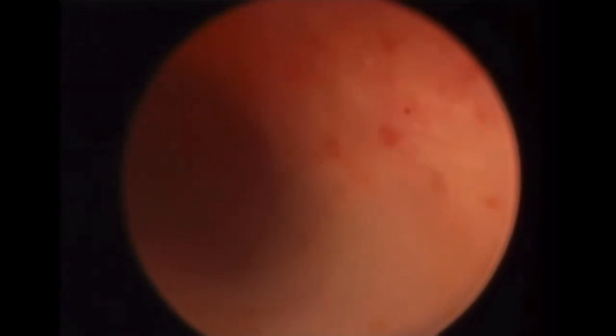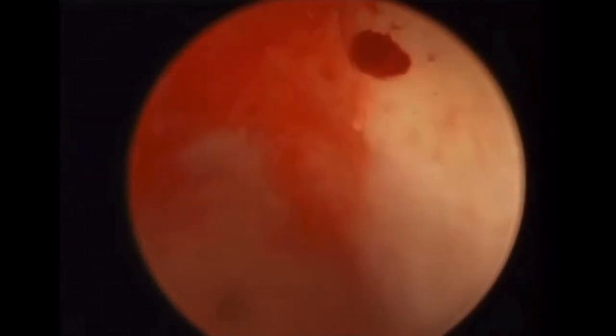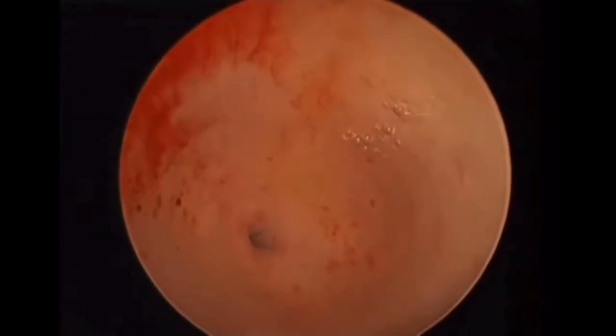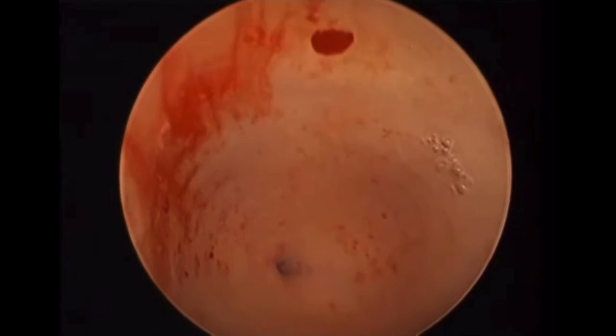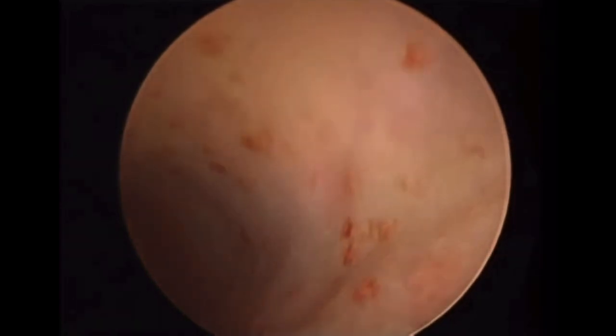Stand and pause a little. Give it time. Don't push your hysteroscope like a uterine dilator. Rotate the telescope to direct the jet wash to hit the uterine wall. You can see there is some blood adherent to the wall of the uterus. If you start your surgery in this situation, you will definitely not be seeing well. Direct the tip of your hysteroscope sheath and push a strong jet of fluid to clean all these blood clots and reach a comfortable, clear view.